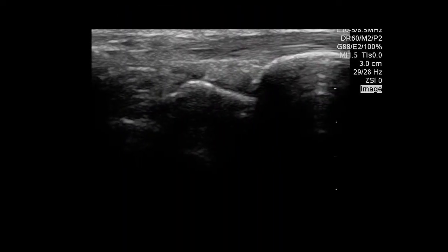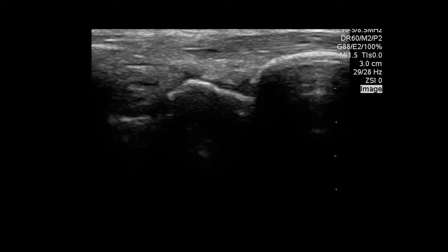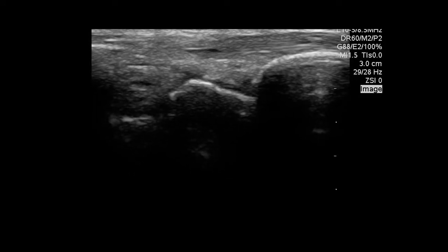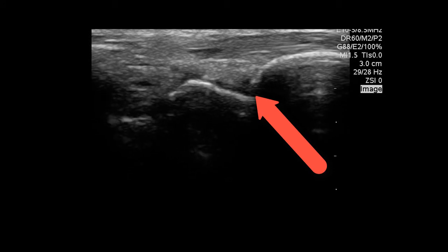This is what a normal wrist looks like. Typically you're using the linear probe and you place it in a sagittal fashion over the radiocarpal joint. If fluid were to accumulate, we'll see it between the head of the radius and between the carpal bones seen right here.